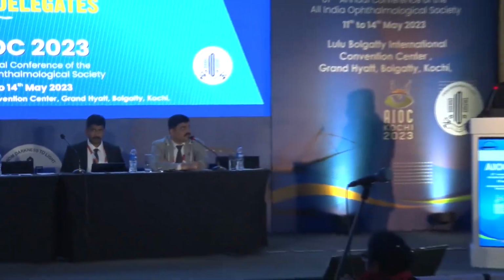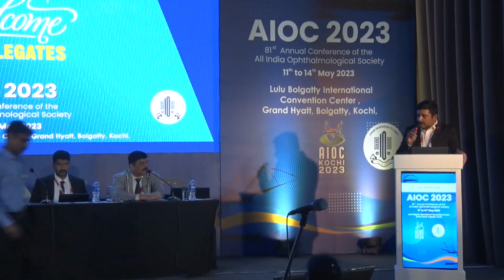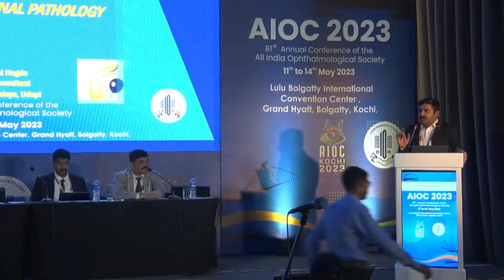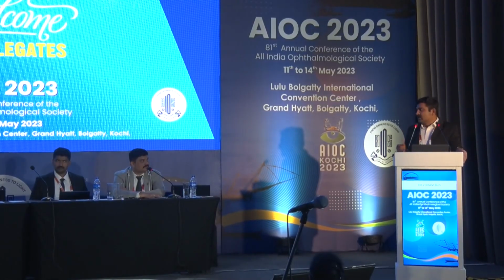One question for you, Dr. Sharath: you're showing draining the fluid out from over the IOL, correct? So can we wait for some period, or do you have to take them for surgery immediately? Yeah, it depends. If it is a homogeneous fluid, not much obscuring the vision, and the patient is not symptomatic, you can wait. But if it is a turbid fluid obscuring the vision, and you're not sure whether it is an infective or inflammatory pathology, definitely you can remove it.